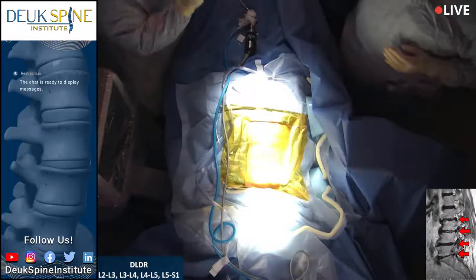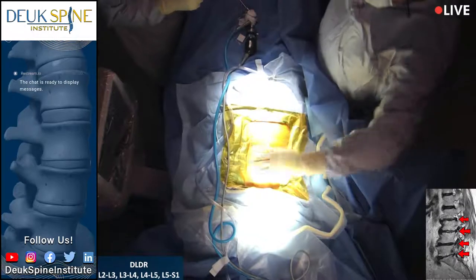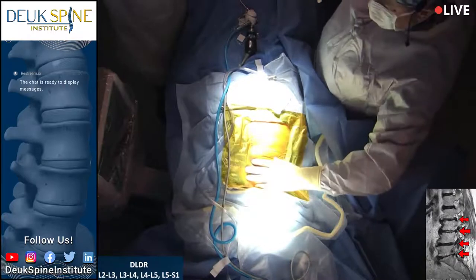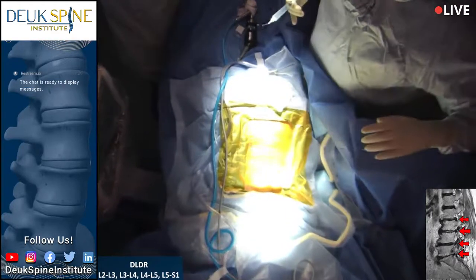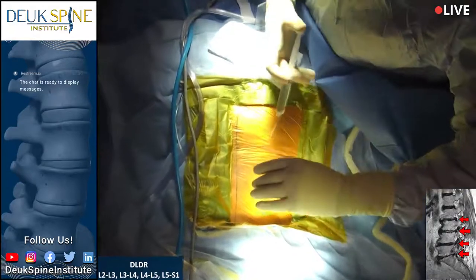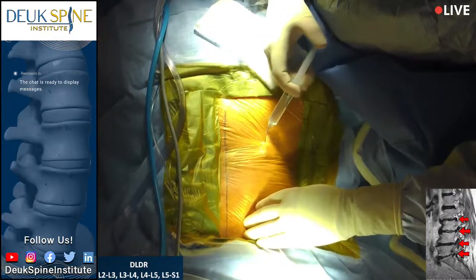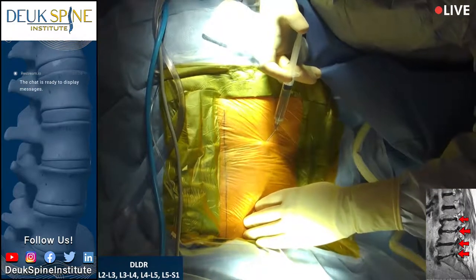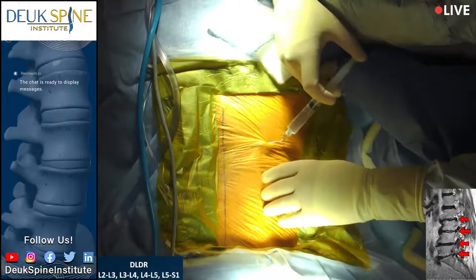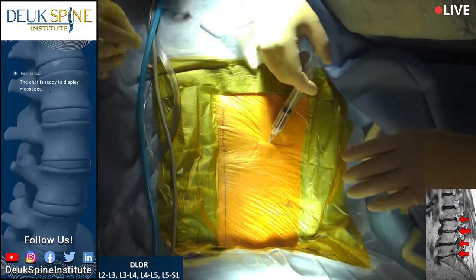Today our patient is having four discs repaired in the lumbar spine. Good morning, Dr. Deuk. I'm going to give you some numbing medicine, okay? If you have any pain, just tell me, but don't try to move around. So I'm going to probably have to make two incisions. One will be at L5-S1, L4-5, maybe L3-4. The other incision will be up at L2-3.